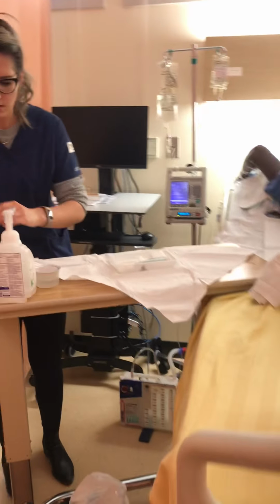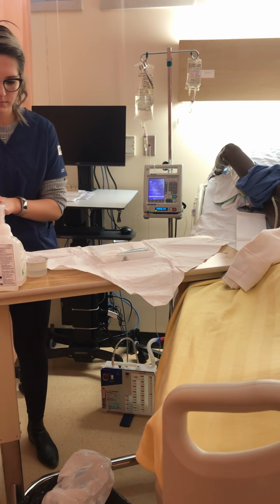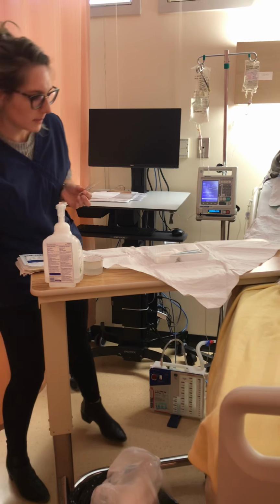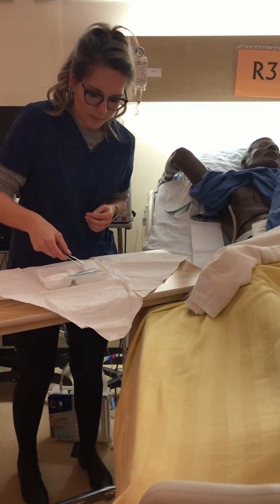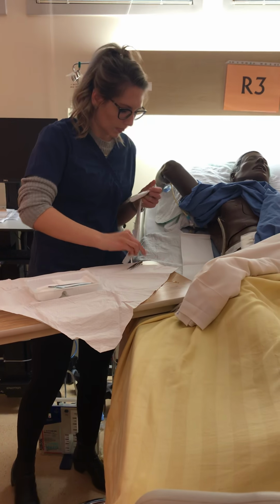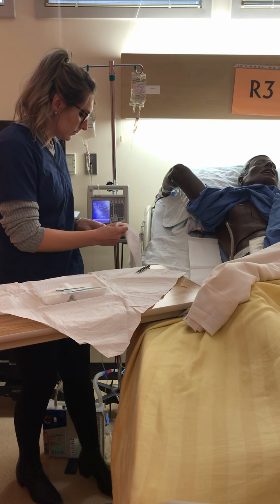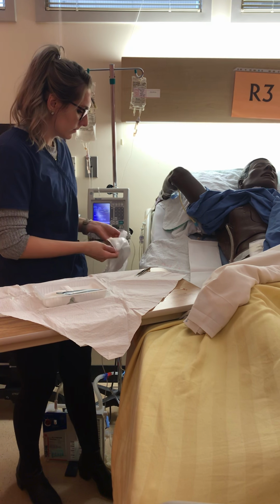Don some clean gloves. Okay, so I'm just going to take my extra forceps here. I would have an extra. I'm just going to pass myself my garbage bag. Can I set my garbage bag up over here? Okay, first step. Okay, thank you.